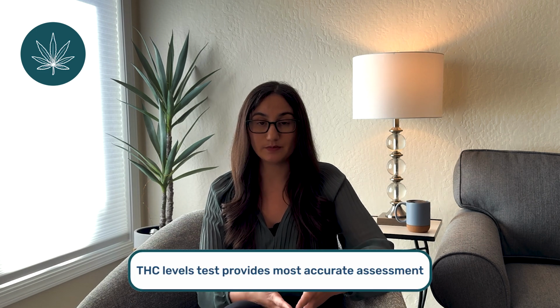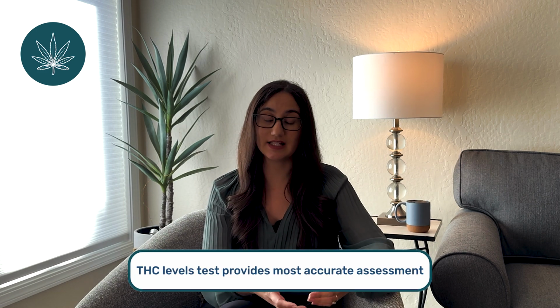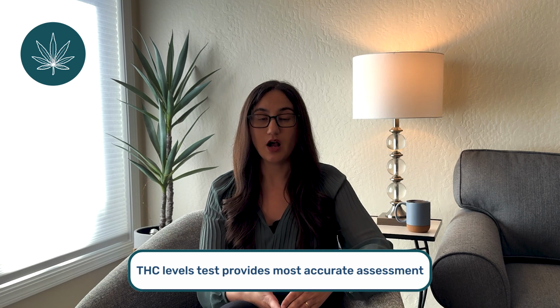If you are concerned about cannabis use mainly, my recommendation would be to go to a lab in your area and ask for a THC levels test. A definitive test is going to give you a more accurate idea of how much THC is being found in the body. That can give you a better idea of how long it might take before you see a negative result at home.